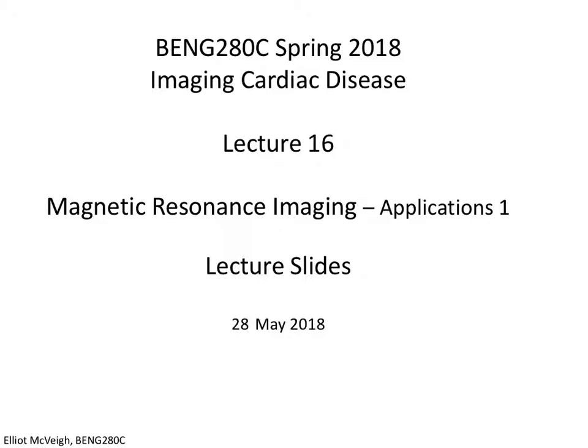I think MR, we've been doing cardiac MR since the mid-'80s, something like that. As soon as MRI was possible, people started imaging the heart with it. Obviously, in the early days with MRI, it took quite some time to make a single image, because the early scanning techniques are fairly slow. So it was difficult to make cardiac pictures, but gating to the ECG is something that was done early on, and reasonable pictures were made very early.